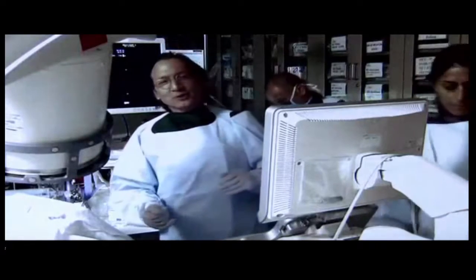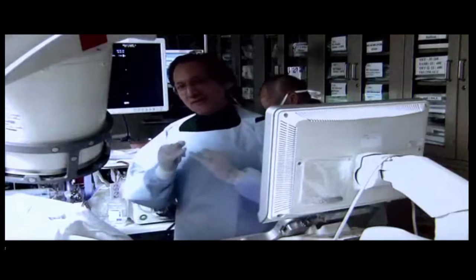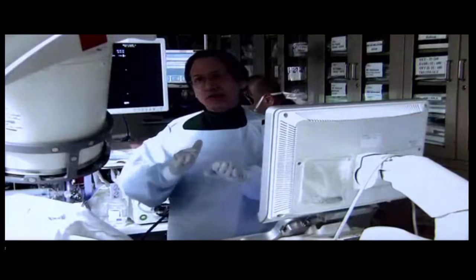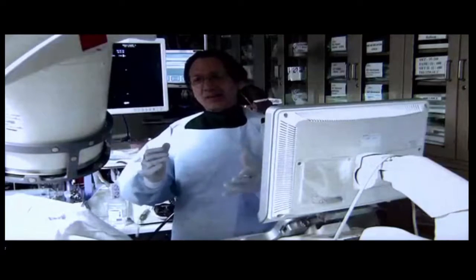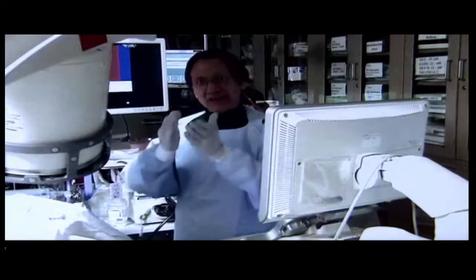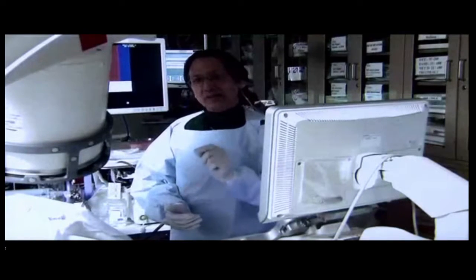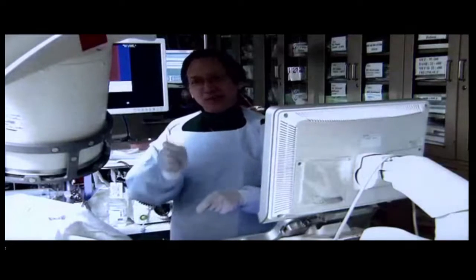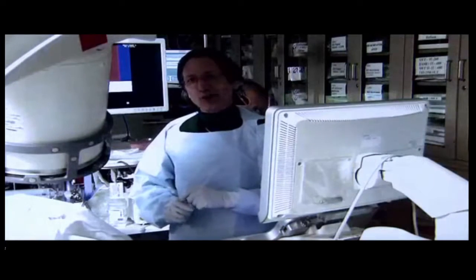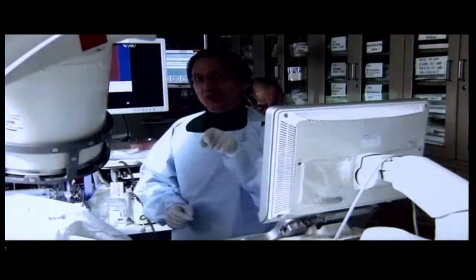Do you know the forward view scope from Olympus has recently been released, with the advantage of an overlap of your ultrasound scanning field and your optical field? So your endoscopic field and your ultrasound fields overlap. So now you have the ability to look with ultrasound, see your target, and then, for example, if you pass your needle into your target, when you look endoscopically, you're going to see that needle right in front of you.